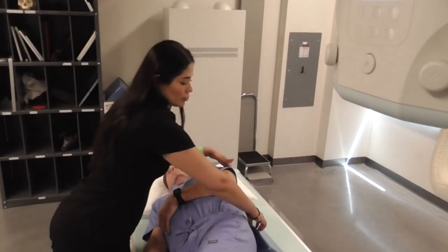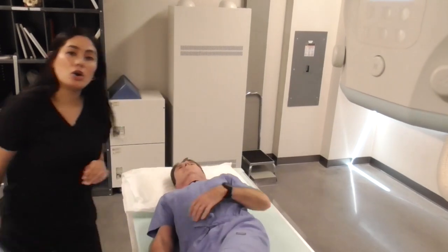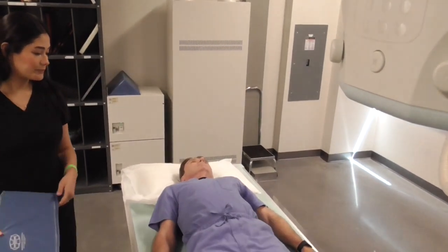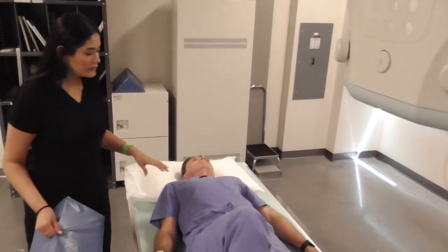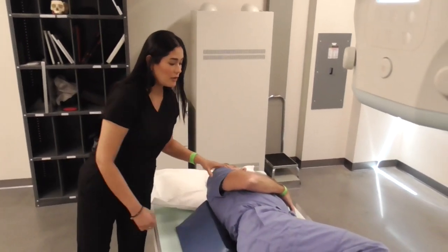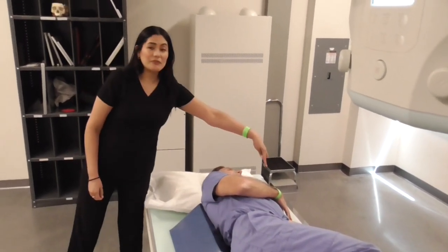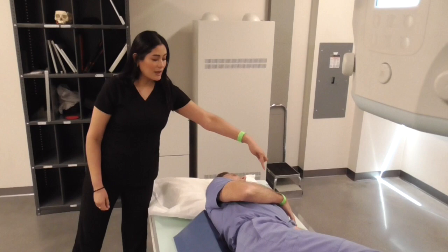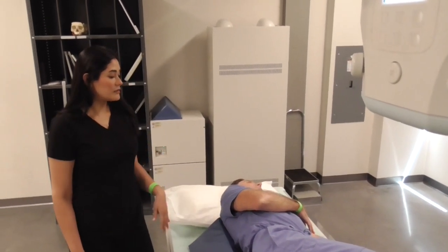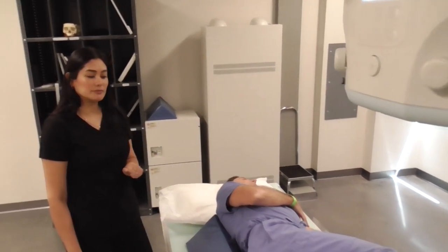We're going to do the same thing on the other side. We are going to do an LPO, a left posterior oblique. So I'm going to have you roll. His left posterior side is closest to the IR, and this is an LPO.